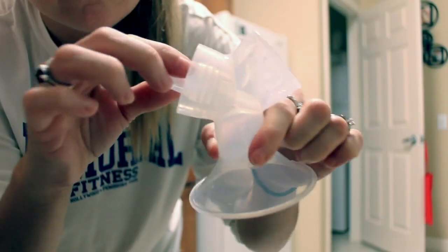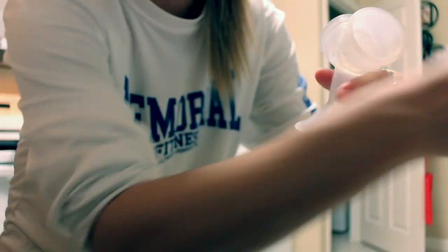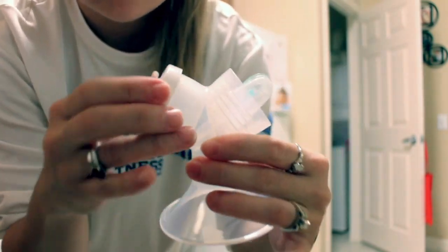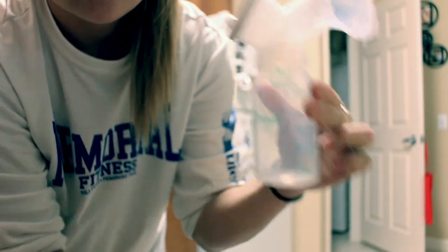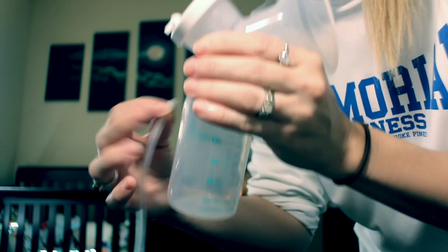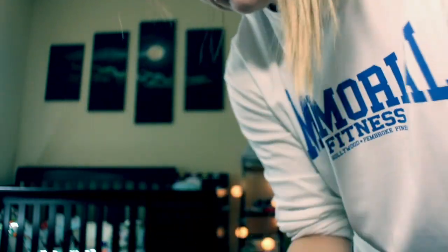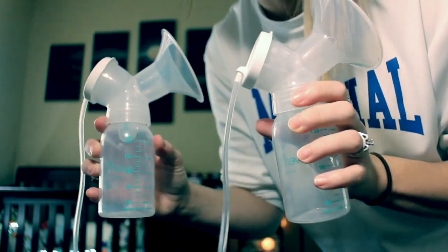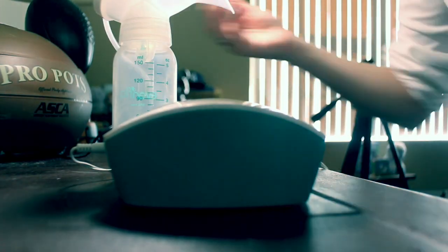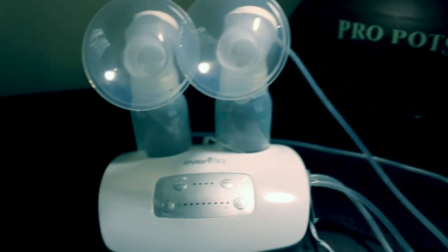Here's what all the parts look like once they're disassembled, and here I'm putting them all back together. Once you're done with that you hook it back up, place it in the holder, and this is how it looks once it's clean and ready to go for the next pump.